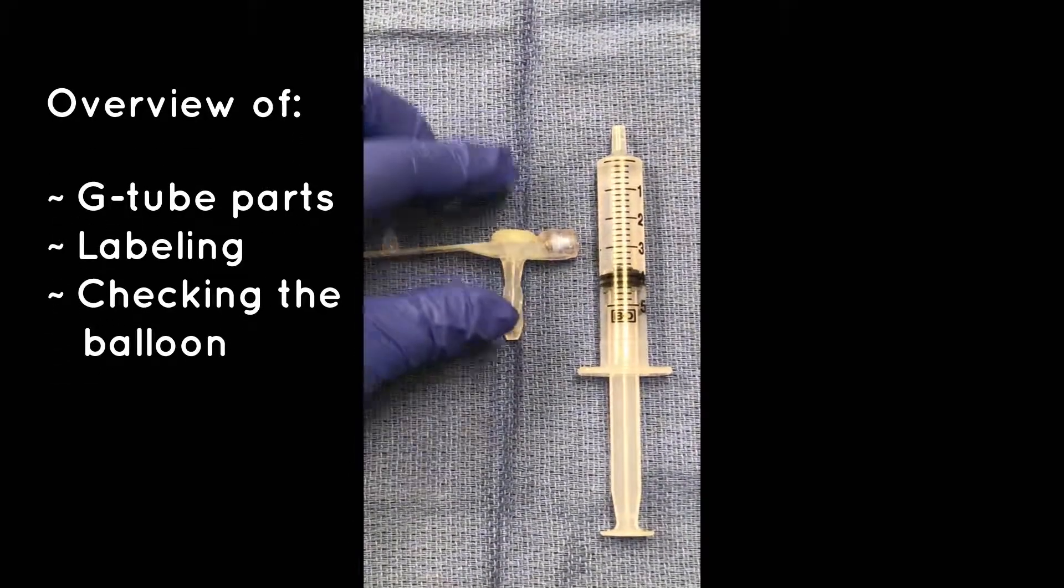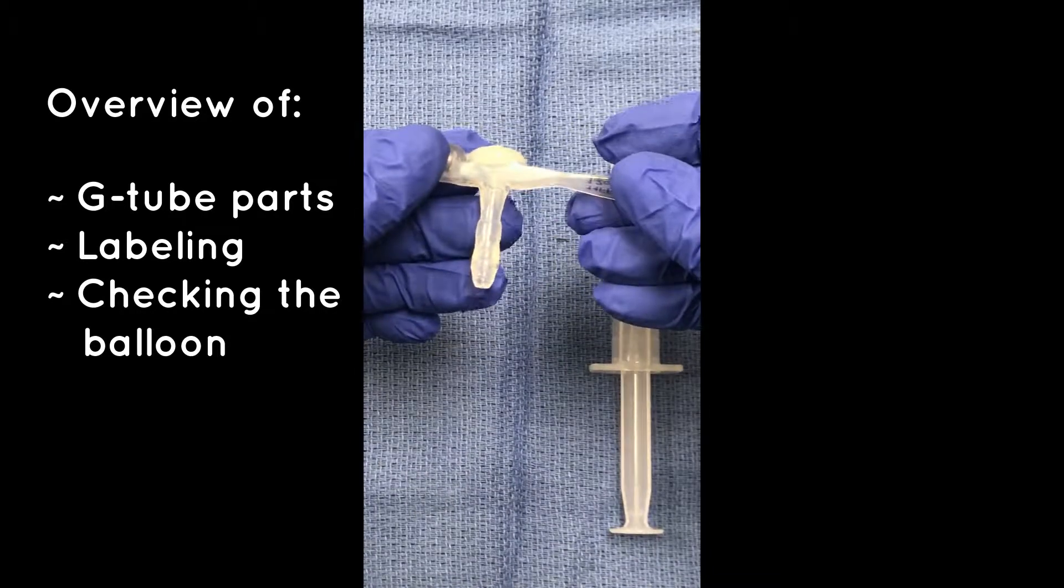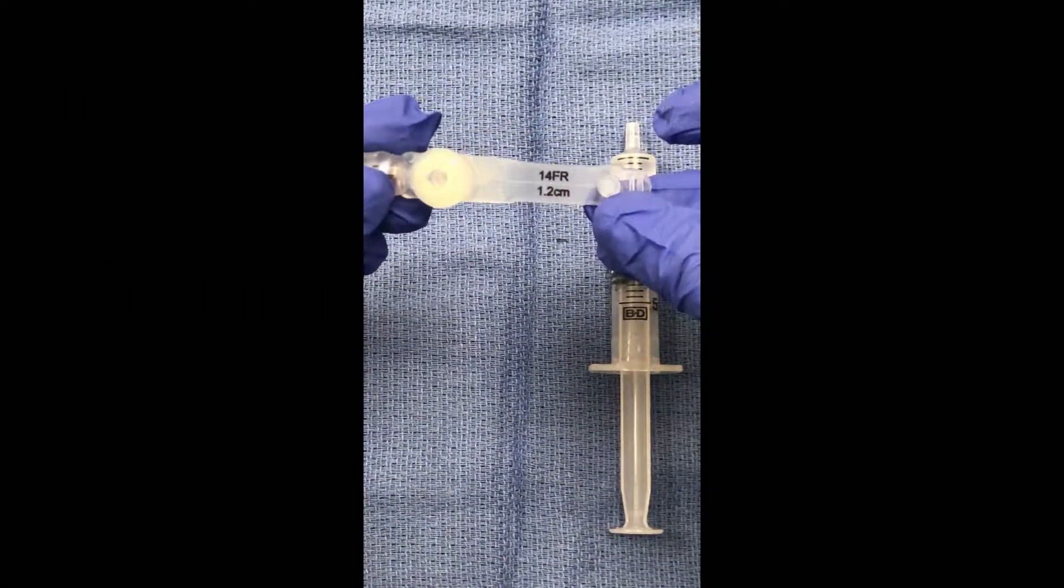Parts of a G-tube and how to inflate and deflate the balloon. First you'll notice on the silicone flap that there will be sizes for each G-tube.